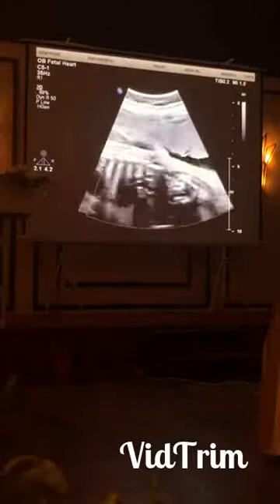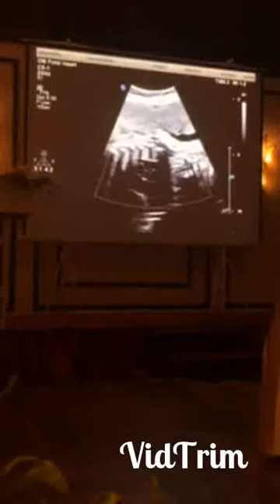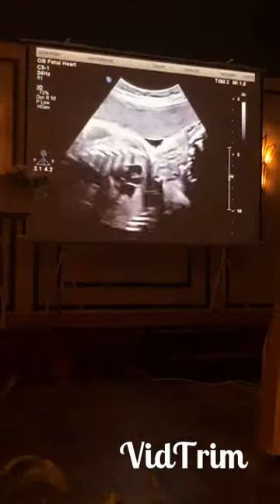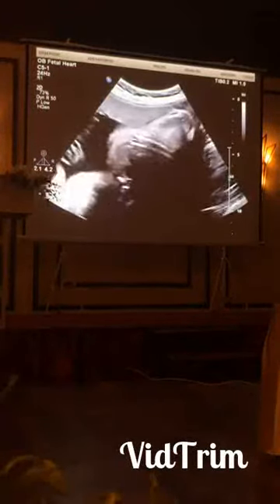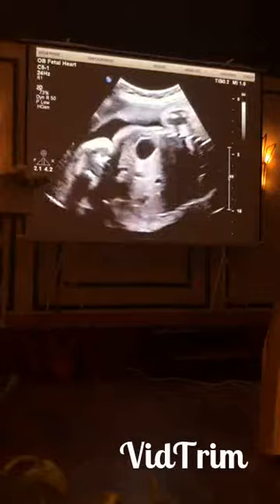I tried to get this sagittal view. Yeah, but I think it's also important that people can see that the sagittal view is tricky, and sometimes they are really difficult to get.